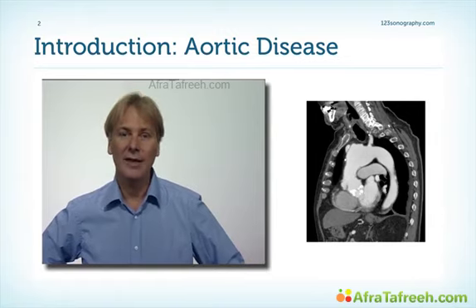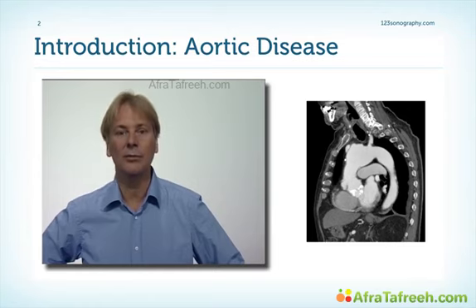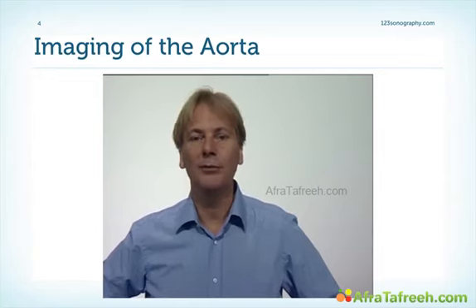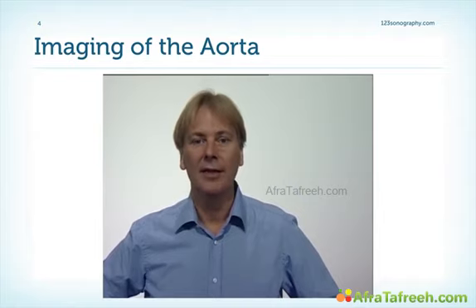So, transthoracic echocardiography also plays an important role. And this will be the topic of this chapter. Imagine you perform abdomen sonography and you would not describe, for example, the gallbladder. The same is true for the aorta and echocardiography. I believe that the aorta should be described in every report.